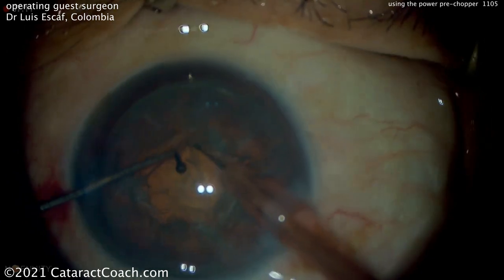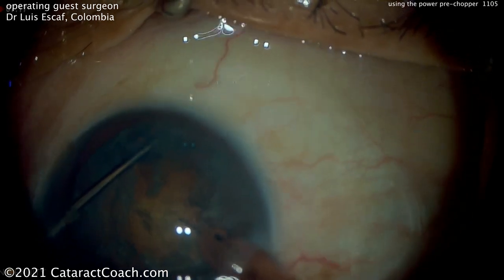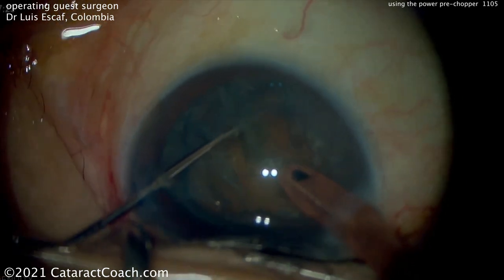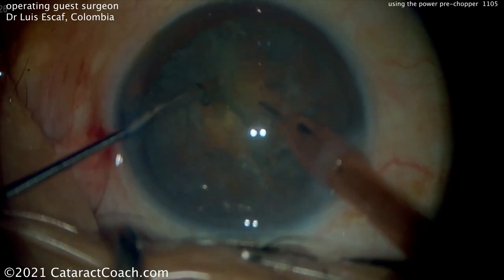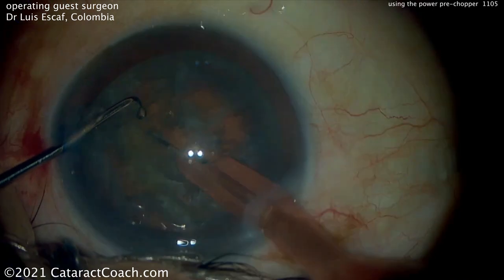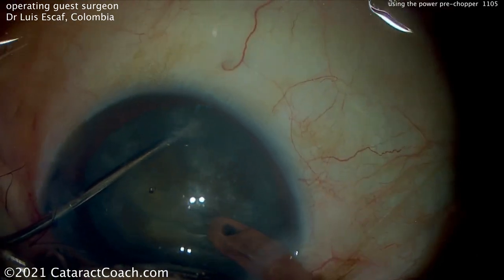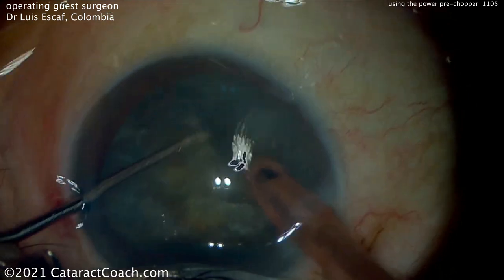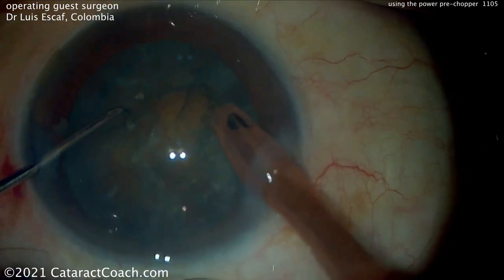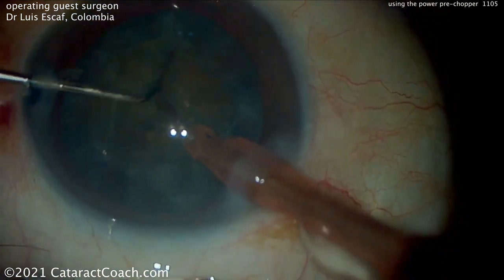So there's that device, and this is invented by Dr. Escaf. He'll rotate the nucleus around a little bit here — you just got to be very careful in the way you place this. He's obviously an expert at this. So you can see that pre-chopper is placed; it goes right through the nucleus, and you can just split the nucleus into pieces very easily. It is a power pre-chopper, you can tell. And then you can rotate the nucleus and do it again, subdividing the nucleus into smaller pieces. The chopper going through it — actually just using the right hand as a second hand now. So the power pre-chopper was used for the first piece, or the first split. And now, even without extra power, it can be split quite easily.